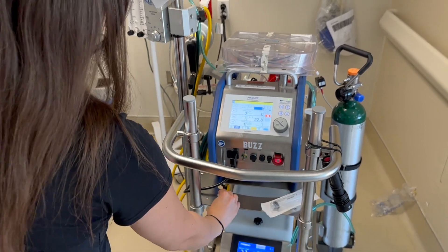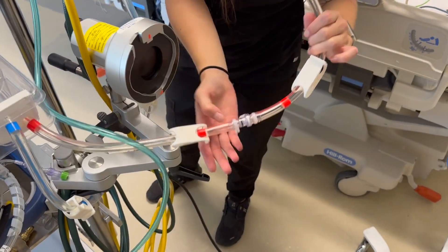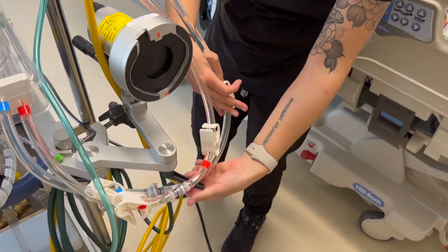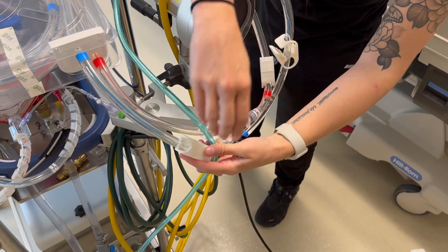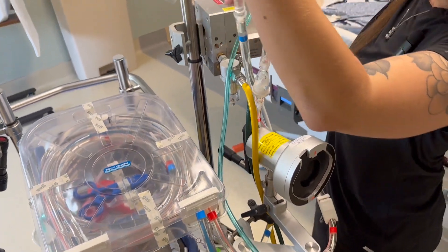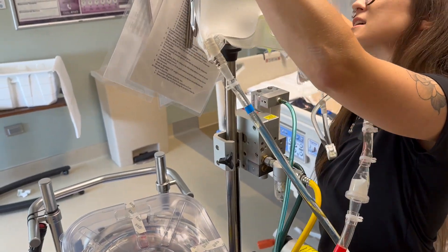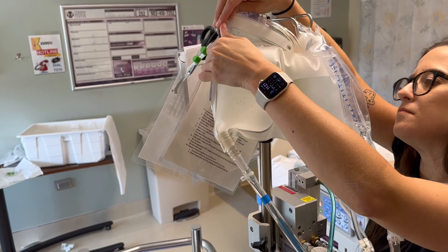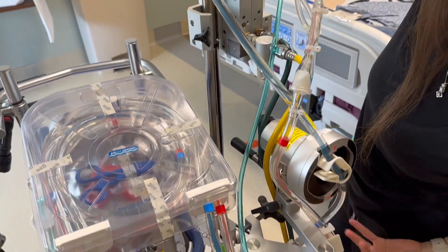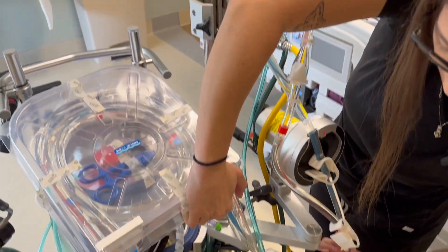Now you're going to open up the Roberts clamps on your red line and then your blue line. Open one and then two on the red line, and one and then two on the blue line. Now it's going to passively prime. You may have to move your prime bag to make sure it doesn't suck any air and only gets the Isolite. Also make sure your lines don't get kinked, or you won't get Isolite out of the prime bag. You may have to untangle some things and that's okay.